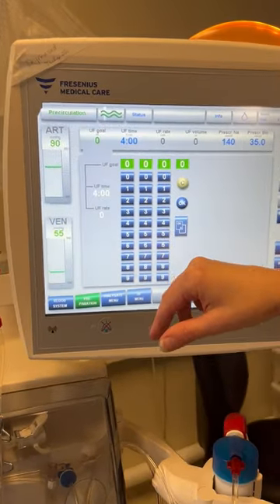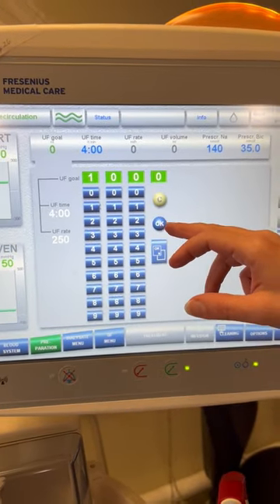Right now we're into programming our UF goal — how much fluid we're removing. So 1,000 mils.